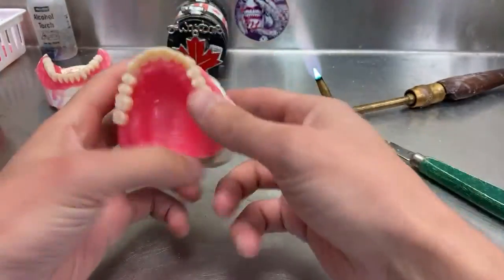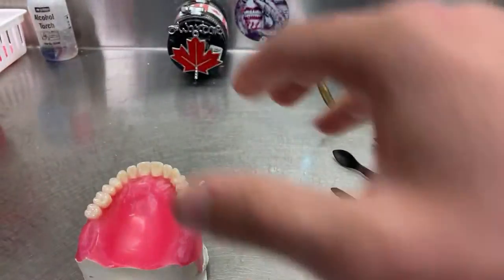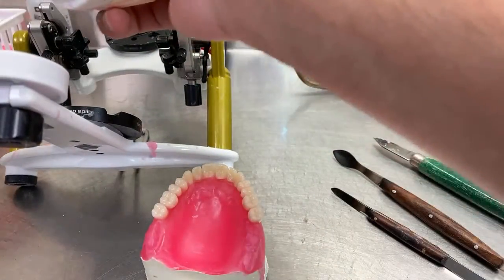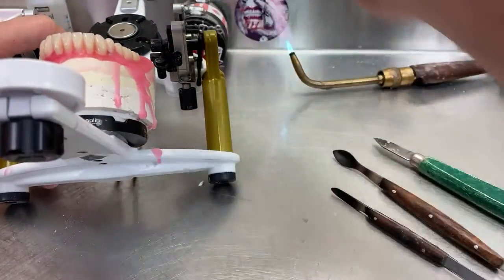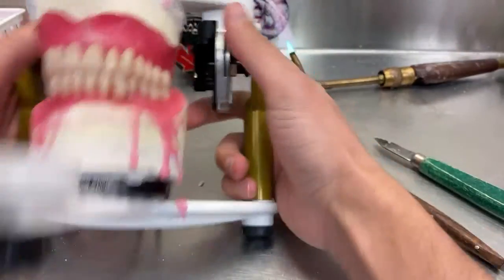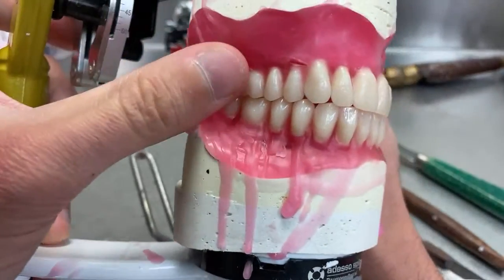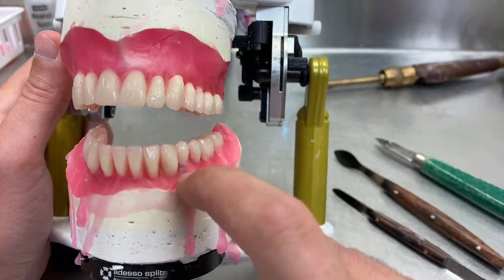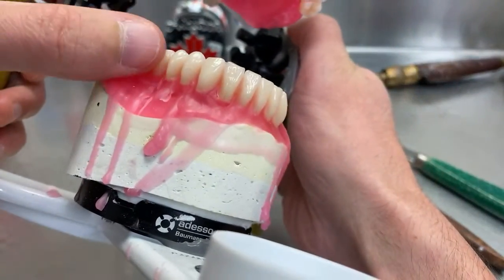So what I'm going to do is the basic regular wax-up for this case that I set up in the morning. And I'll show you something here that I did freehand. I don't know if you checked my last video about how to get a balanced occlusion while you're setting the teeth. This one was treated the same. What I did is I set it up with a little curve here, freehand. I didn't use anything. You can actually see it. And this case has an implant. That's why you see this dark spot here. And the other one is right under this canine.